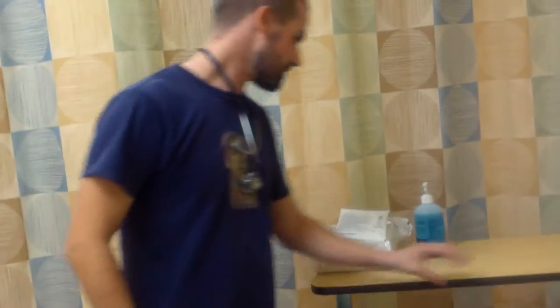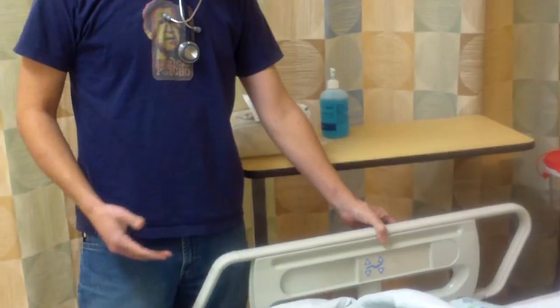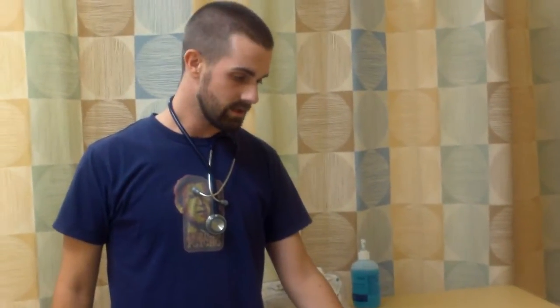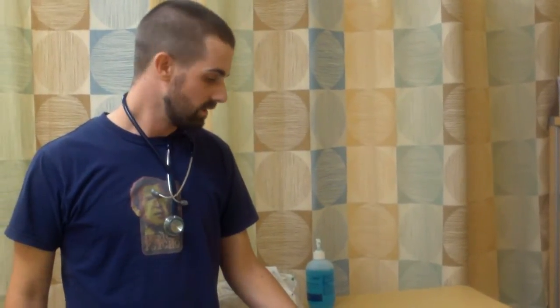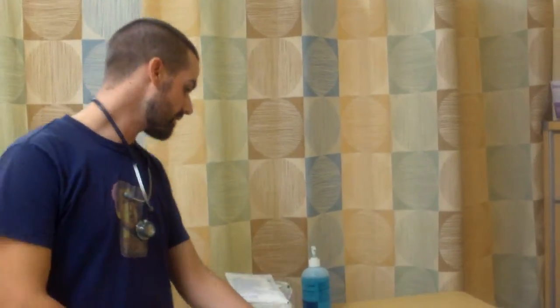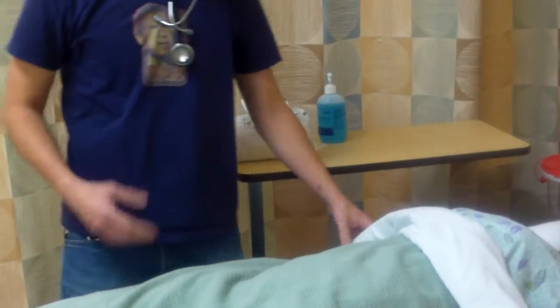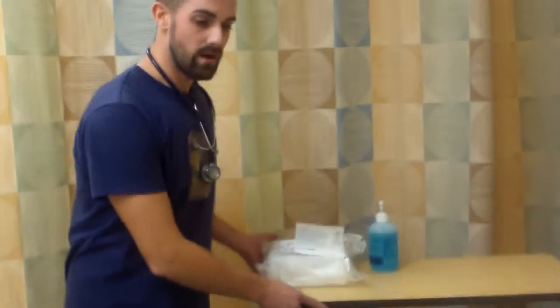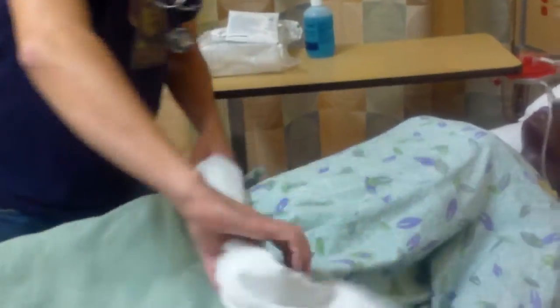Good hand hygiene again, if I haven't already done that. And then I'm going to explain the procedure, saying that I'm going to do an abdominal assessment. I'm going to make sure we have the need for a Foley catheterization. So once I do my abdominal assessment, we'll go ahead with the Foley catheterization. I would let her know that it is an uncomfortable procedure, and let her know what to expect. But she will feel a lot better after the catheterization. So then after that, I'm going to do an abdominal assessment. So I'm going to be providing for privacy, trying to be modest.